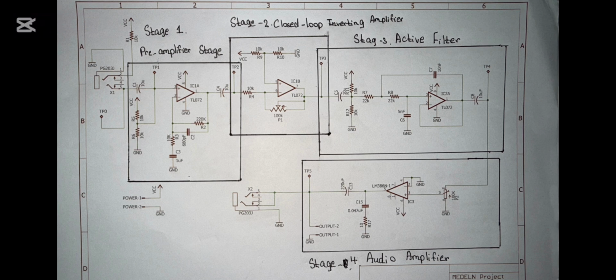There are 4 stages the signal has to pass through. Stage 1, preamplifier stage from test point 1 to test point 2, and stage 2, closed loop inverting amplifier stage from test point 2 to test point 3, and stage 3, active filter stage from test point 3 to test point 4, and finally stage 4, which is audio amplifier, which ends at test point 5.